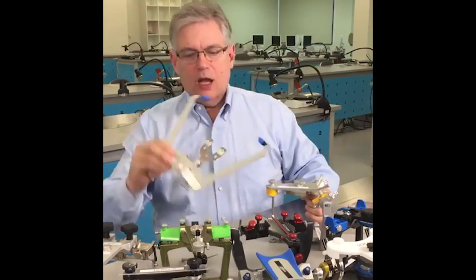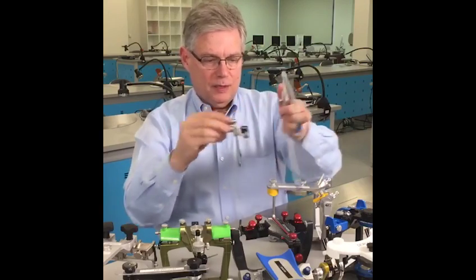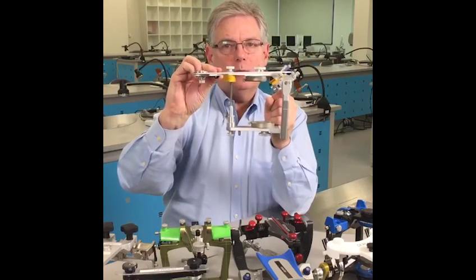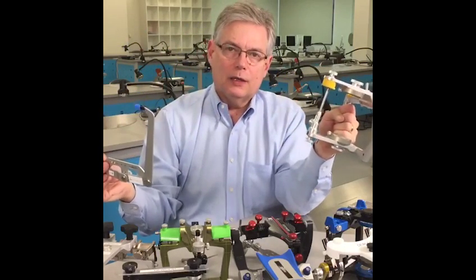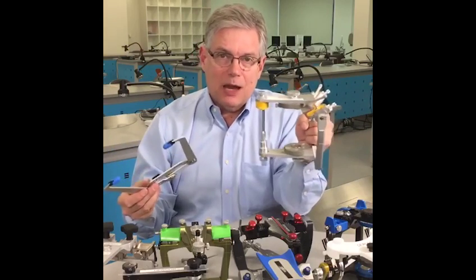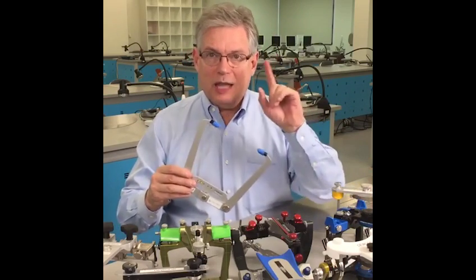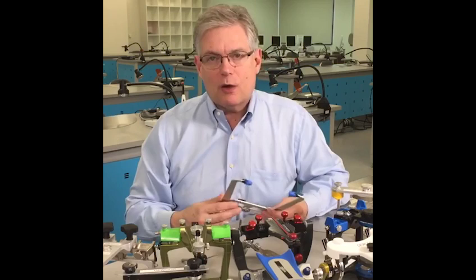Here's how the tip happens. Every system out there, once I record this and tighten this up, will always take this jig. I'm going to pull the jig off and show you the jig. Every system will take this jig and when you mount it, that jig automatically makes this — no matter where you recorded it — parallel with that upper member. Every one of them. So if I have recorded this on a face where this is tipped up, it will tip the model down forward, changing the occlusal plane. We're going to recommend that that's a reference you might want to have because it can be really helpful if you're working with occlusal planes or incisal edges. In many mounted cases, those are two things that are really important. The concept of doing that is not a new one. It does create some problems occasionally in spacing, although they're rare. There are workarounds for those things.